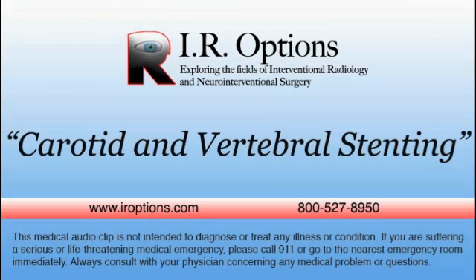Carotid balloon angioplasty and stenting are performed with a small retrievable endovascular filter that protects the cerebral circulation from any debris that may result from these procedures. The recurrence of vascular narrowing following stenting is comparable to that of open surgery, but the recovery time is far shorter, and the impact of general anesthesia and neck nerve damage are absent with the endovascular approach.